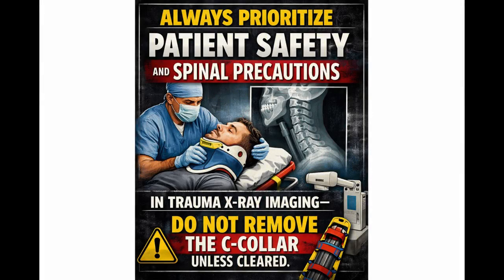Always prioritize patient safety and spinal precautions in trauma imaging. Do not remove the C-collar unless cleared.